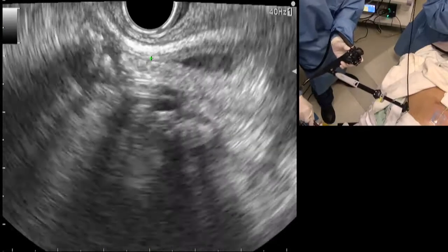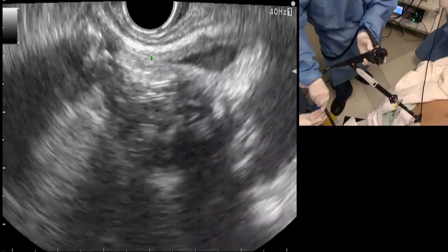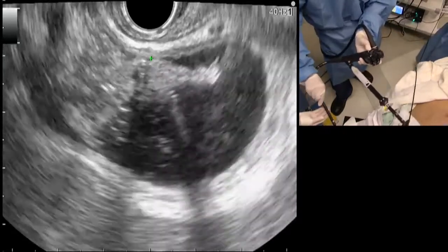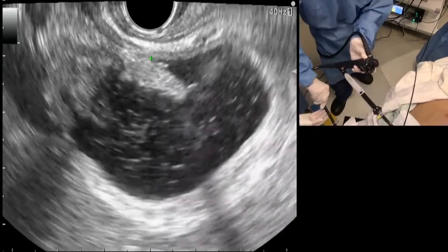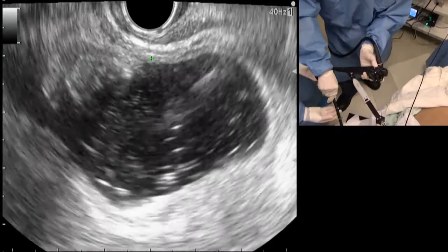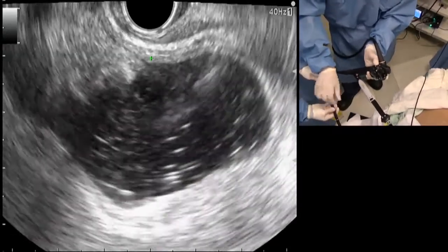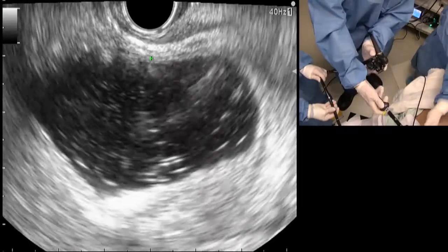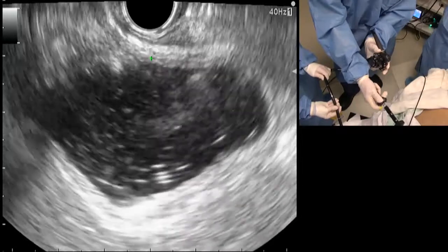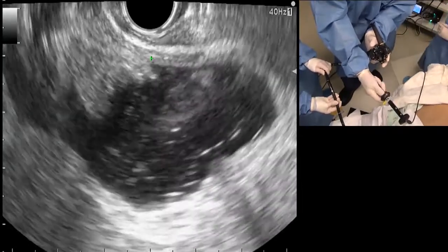If you're here, you're too close to where the cholecystostomy tube is, and it's probably more like the fundus area, I guess, or I'm not sure. Maybe the fundus is the right side. It's hard to know exactly, but so we'll turn around, and we really want to target the anechoic area, right? So just kind of hold that like that. And I'm just advancing now our sheath forward, and I'm looking for the bright echo of the sheath. And I need to see that well.